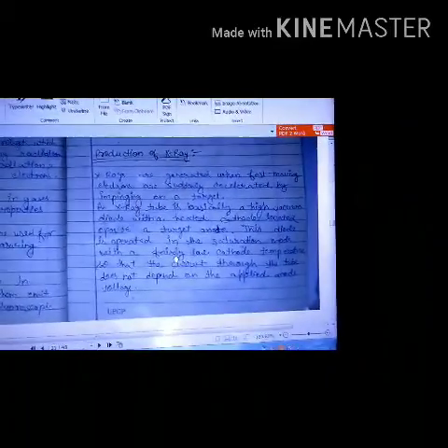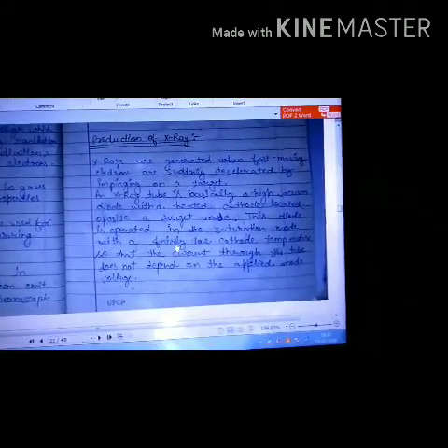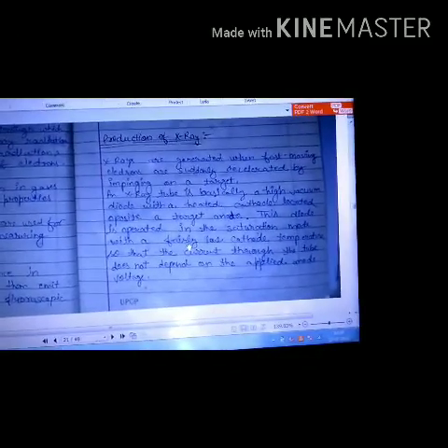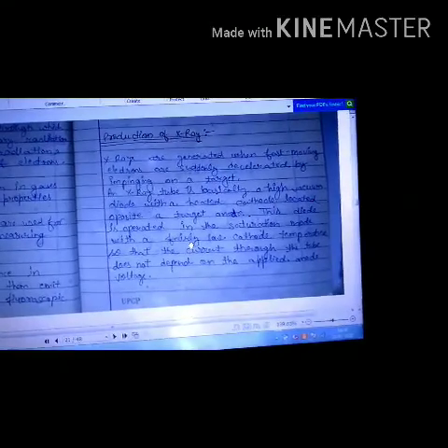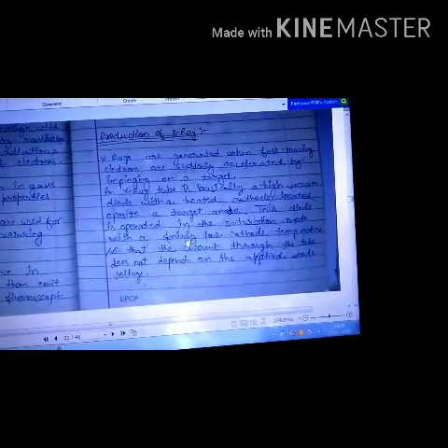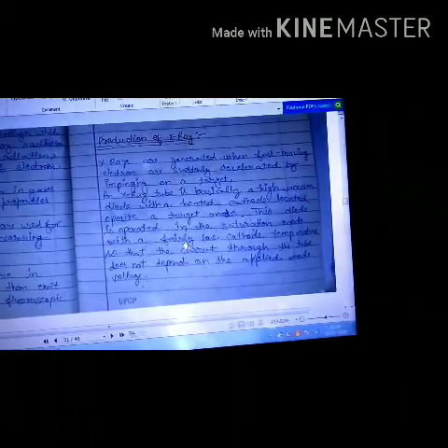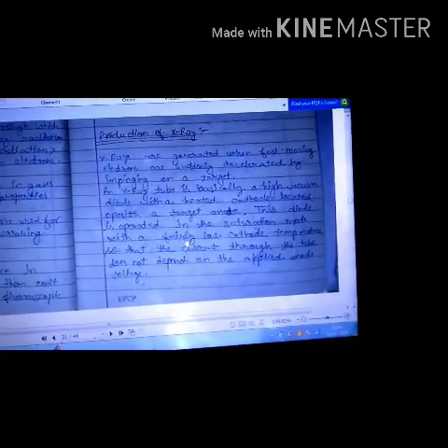Now, an X-ray tube is basically a high vacuum diode with a heated cathode located opposite to the target anode. So we have a target which is normally the anode, and the complete assembly is in the form of a cathode ray tube, you can assume. It is completely in vacuum. At the cathode side there is a heater, which is required for production of the electron beam, and at the anode side there is a target on which the electron beam can hit.